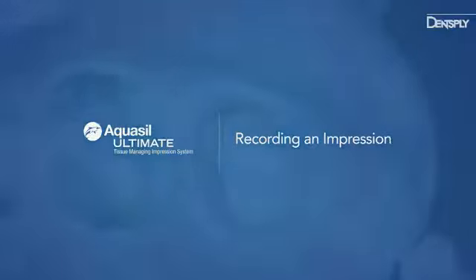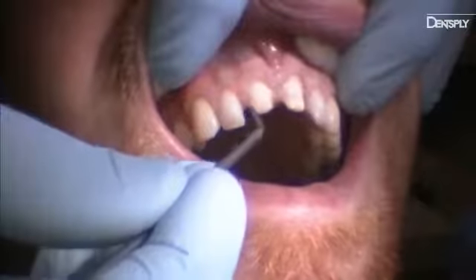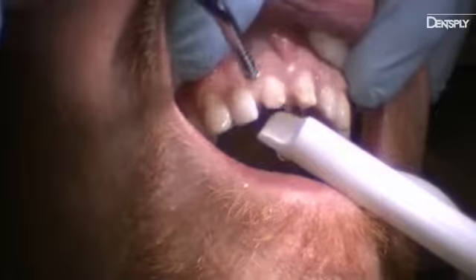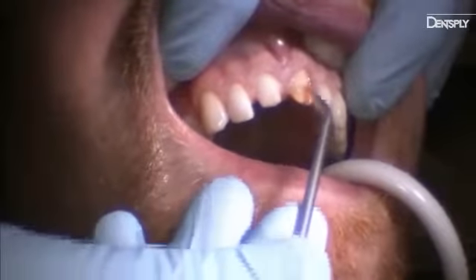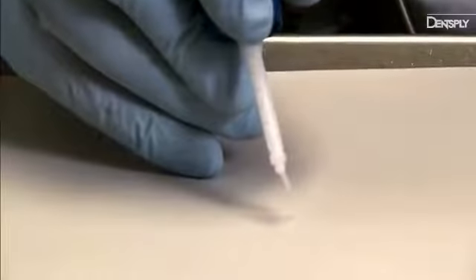Aquasil Ultimate can handle both single tooth and multiple tooth impressions — posterior or anterior — without the use of retraction cord or paste. Start by managing any bleeding with a hemostatic agent. Rinse away any coagulated blood or debris. After hemostasis is achieved, apply B4 Pre-Impression Optimizer and air thin. Grasp the DigitPower Dispenser with a pen-like grip.